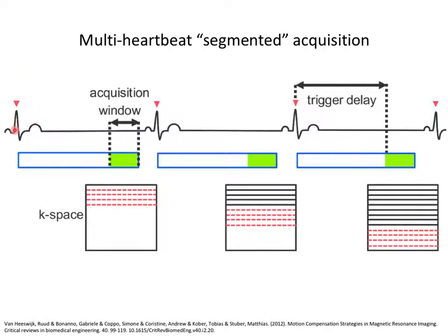However, if everything's clean and there isn't a lot of noise and stuff like that, you can usually find a fairly consistent trigger from the QRS. And so as time goes on, you can mark where that patient has a QRS at each time point. And we will gate or time our acquisition entirely dependent on when this thing occurs. Right?